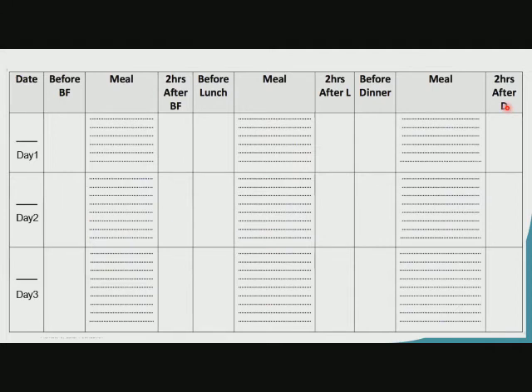So this 6 times, we usually recommend for people newly diagnosed with diabetes or people who have their blood glucose out of range, who don't know where to start, to fill all this table. And it's preferable to fill also the meal details, what you eat, your diet, in those sections, because we want to know your eating habits.